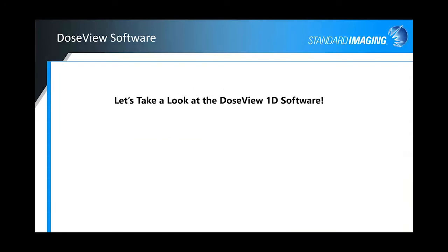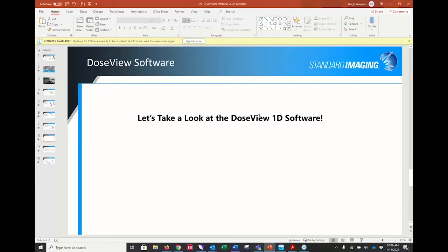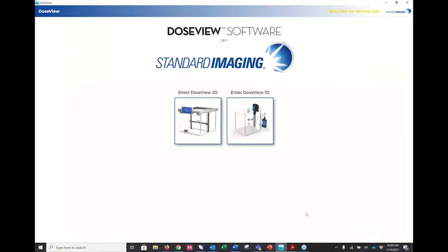So that being said, that's just a quick overview. Let's take a quick look at the software. I want to see if I can maybe get you out of here in about 25 minutes or so. Don't want to keep you too long. I know you guys are all busy with your days, or some are starting your evenings, depending on where you're at. So I want to kind of move along. But let me bring up the software here.